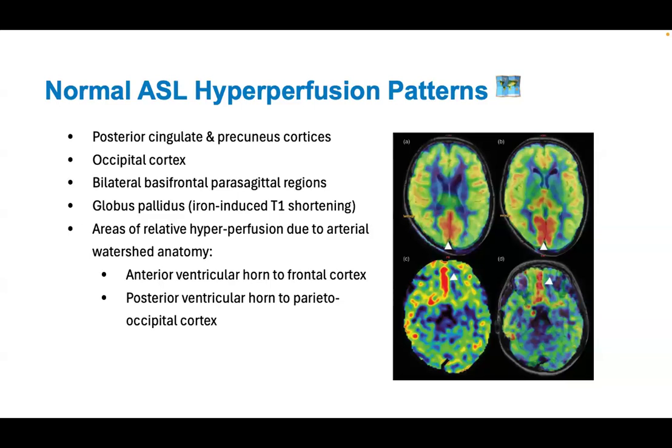So as that Jacksonian march happens, the hemodynamic response function changes with the electrical activity. There can be spread. So most of the time, you can see a march and you will not be seeing the actual site of the epileptic zone. You may be seeing a march. So you have to be very sure. It will usually have some lateralization value, but not exact localization value.